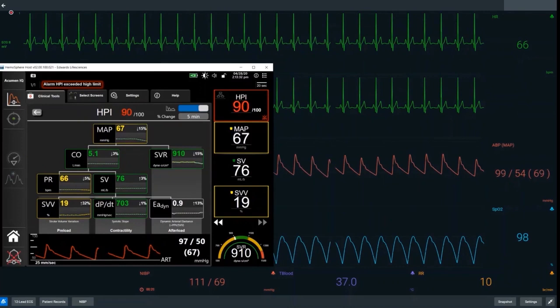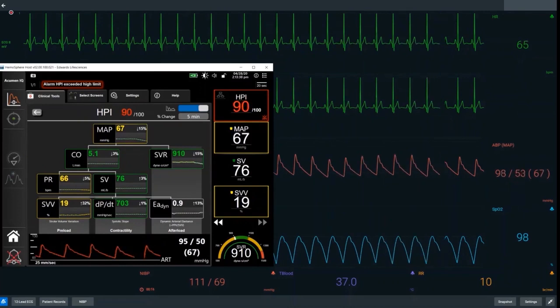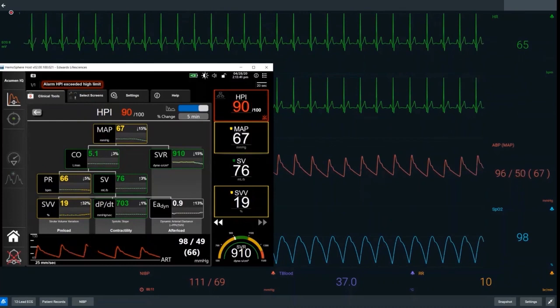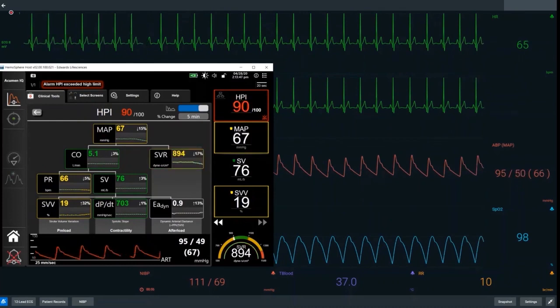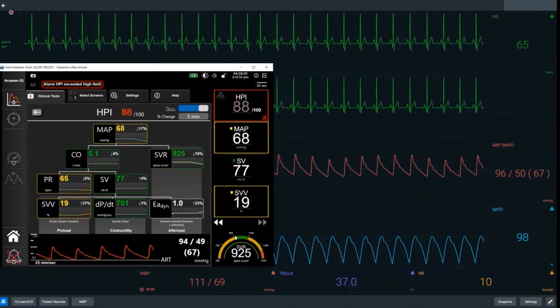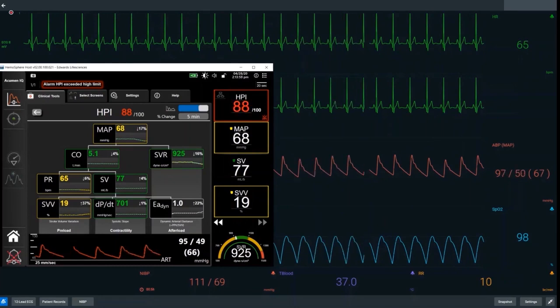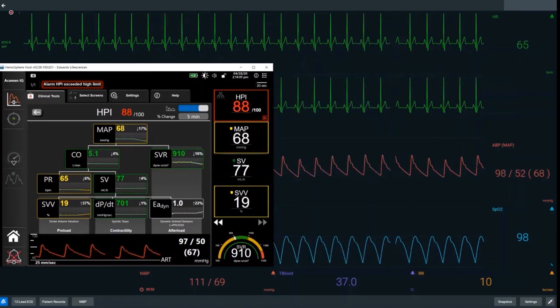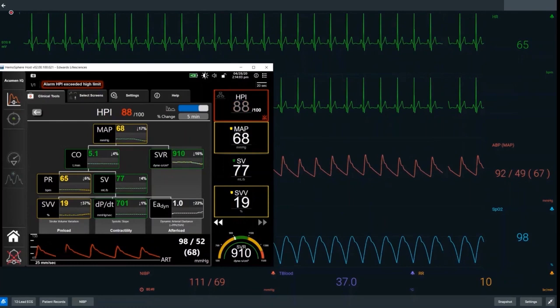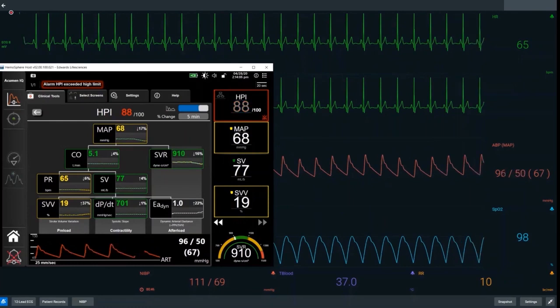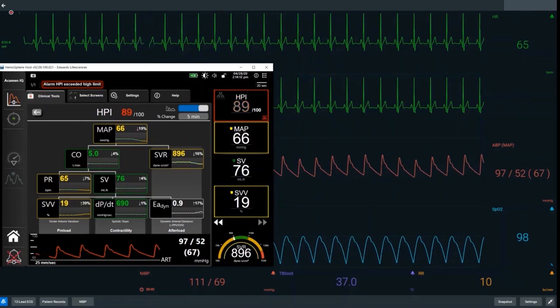The displayed alert allows us to access more information on the secondary screen, where we can interrogate the underlying physiology. We do not treat HPI as a number — we treat the underlying physiology that is leading towards hypotension. Looking at our preload direction, the SVV is raised at 19%, suggesting this individual is a preload responder. However, EADYN — a measure of being a pressure responder — is below the threshold where giving fluid will increase blood pressure.